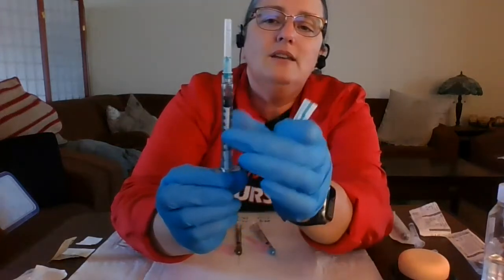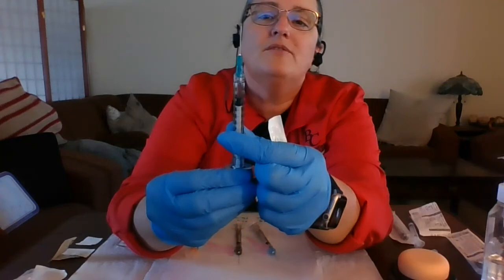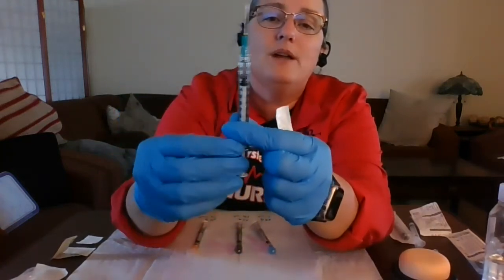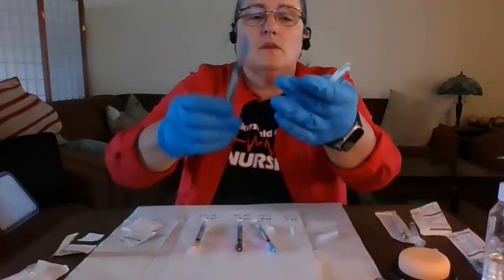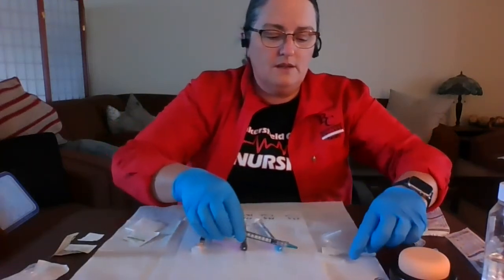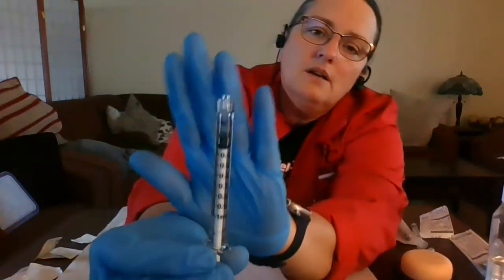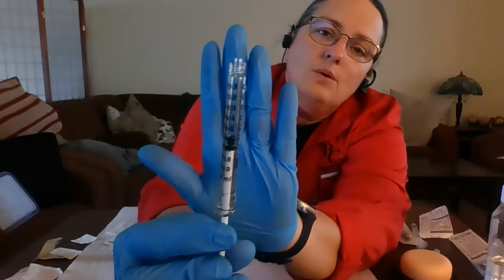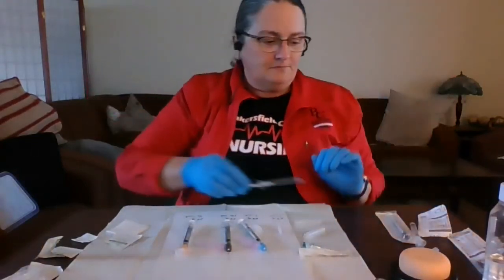And then once we have put our needle on, we're going to pull it off and put 1 drop of medication out the top of that needle to make sure that we have filled this dead space, and then we are at the correct area for our dose. Again, using my safety scooping method to cover that needle. I'm going to show you this a little bit closer. You can see the markings on this 1 ml syringe.